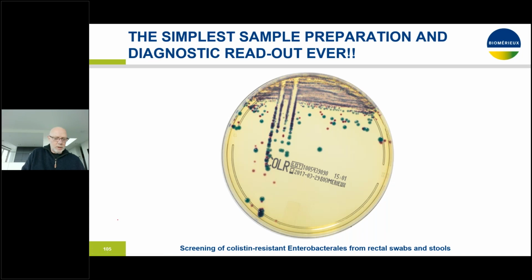So what about classical microbiology then? And you've seen it in many of the slides of the previous speakers. Culture is very, very important. And this is also immediately one of the drawbacks that has not been addressed yet by any of the speakers. For mass spectrometry, for MALDI-TOF analysis, you need a certain biomass. You need 10,000 organisms in order to generate an interpretable spectrum.